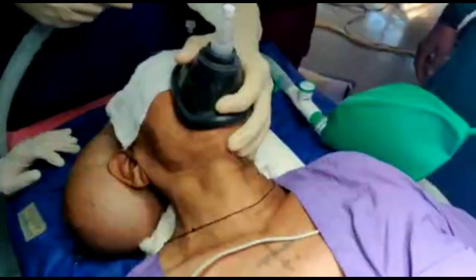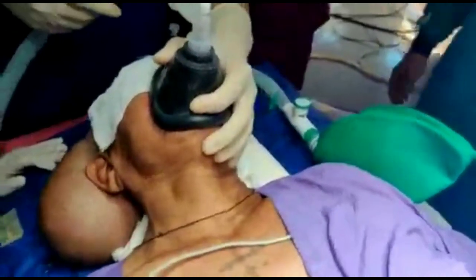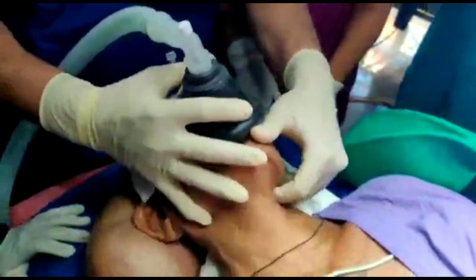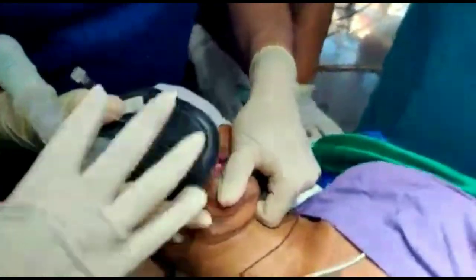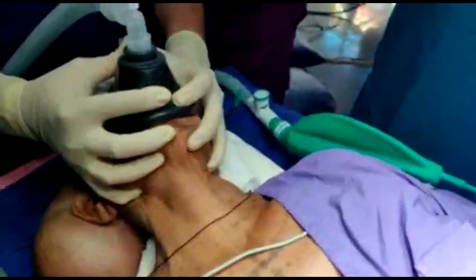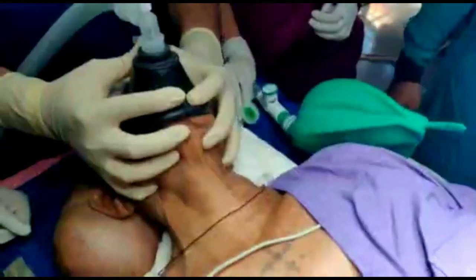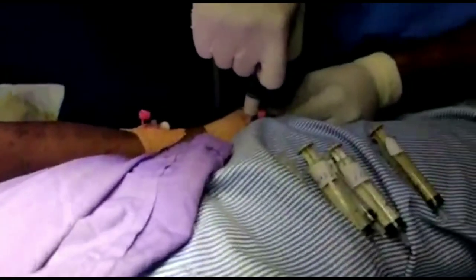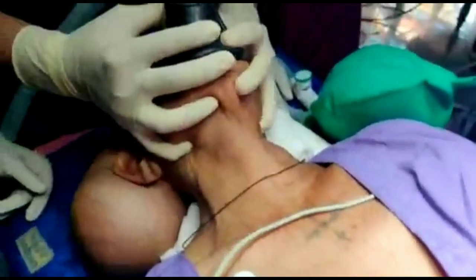Mask ventilation was done properly with 100% oxygen for 5 minutes. Induction was done with injection propofol 2 mg/kg and injection succinylcholine 2 mg/kg. After that, conventional orotracheal intubation was done with a size 7 oral endotracheal tube. Cuff inflated, air entry bilateral equal, tube fixed.